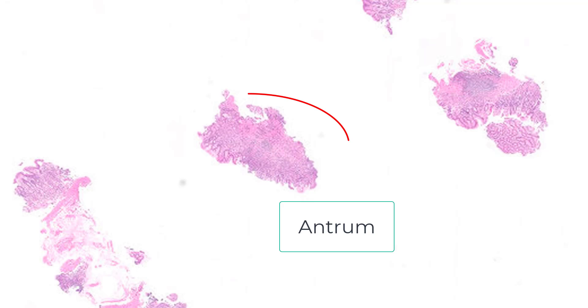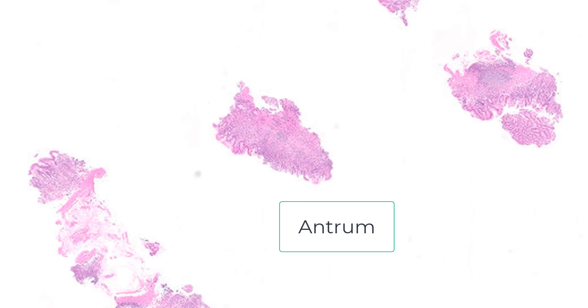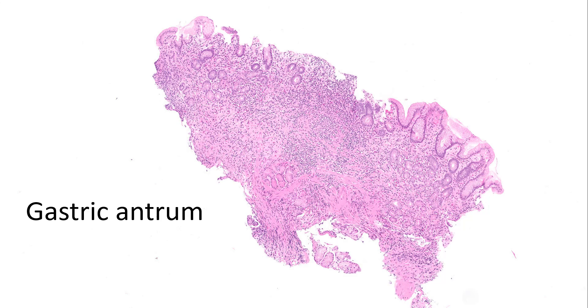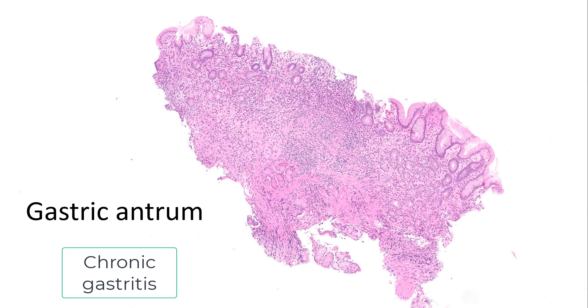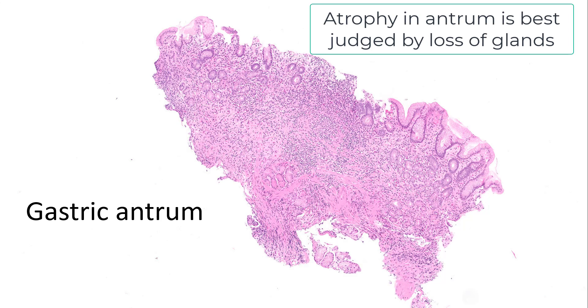Just a few brief words on the differential diagnosis of autoimmune gastritis. I'm going to use this 67-year-old man to illustrate this point. As is often the case, your endoscopist will throw multiple fragments all into one cassette, and it's for you to sift out which is body and which is antrum. This is antrum and this fragment is body. Here's the antrum — I know this is antrum because of my gastrin stain. Notice these gastrin-positive cells. There's clearly chronic gastritis, and this isn't mild — this is significant chronic gastritis.